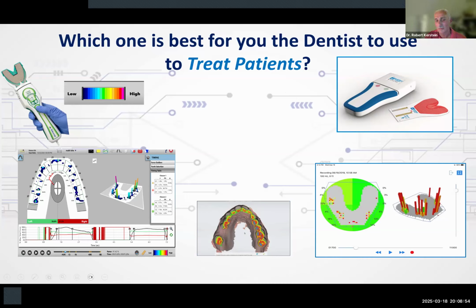These color-coded representations are not force, they're contact proximity. In other words, closeness of how closely teeth touch. But whether the teeth touch well or touch slightly far apart or touch very far apart doesn't translate into being able to recognize what parts of the teeth should be adjusted and how much they should be adjusted. So scanners really can't treat patients either.